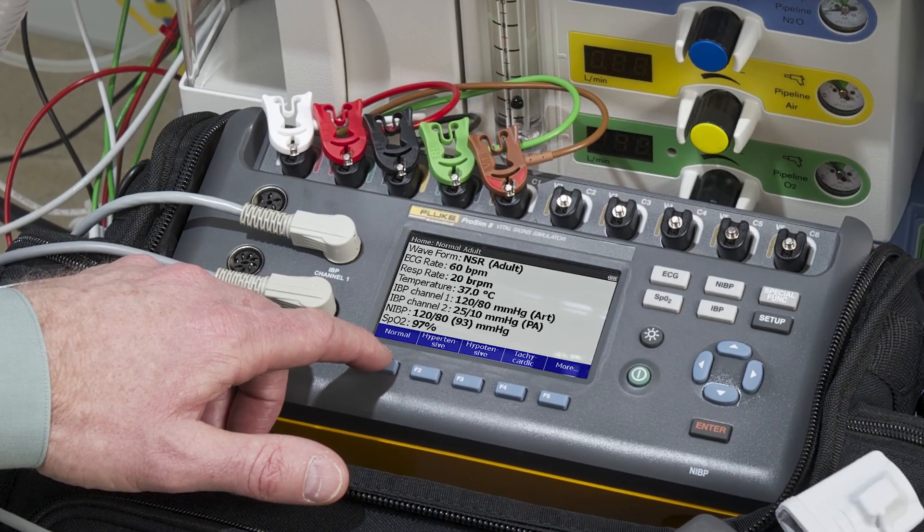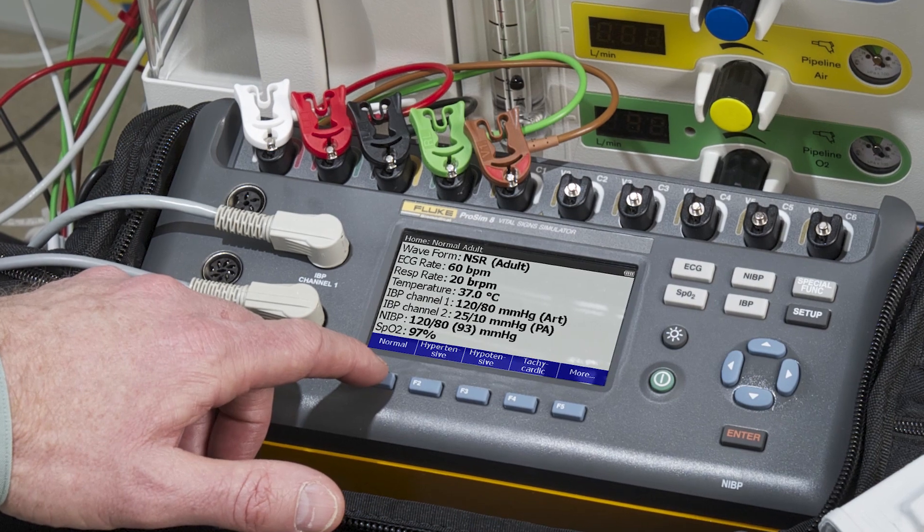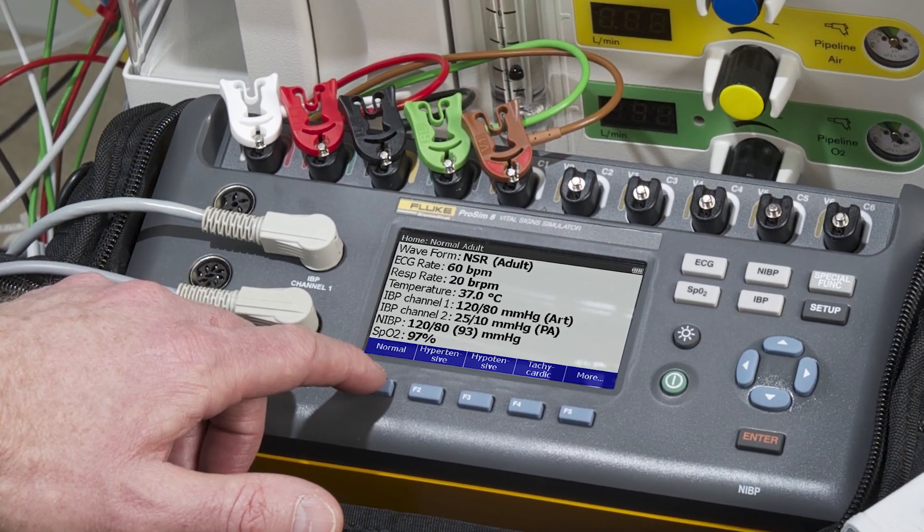Wireless PC communication, customized presets, barcode scanning, and direct data capture and printing functions allow for maximum productivity.